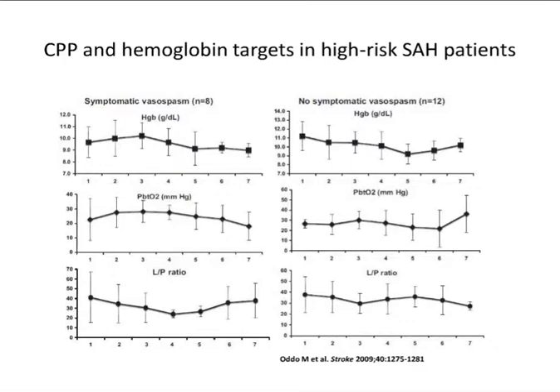And you can also use the combination of the two, brain oxygen and microdialysis, to assess not only CPP thresholds, but thresholds of hemoglobin. When you have a patient at risk for ischemia and anemic, and you see a trend of lactate to pyruvate ratio going up and concomitantly PbtO2 going down, maybe, even if it's probably not evidence-based medicine, but rather medicine-based evidence, sorry, you can maybe transfuse these patients.